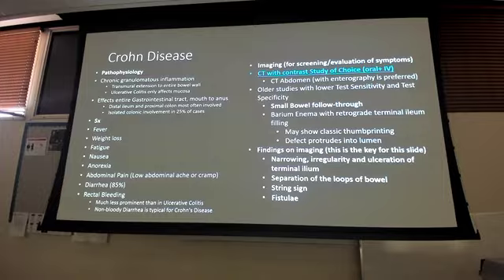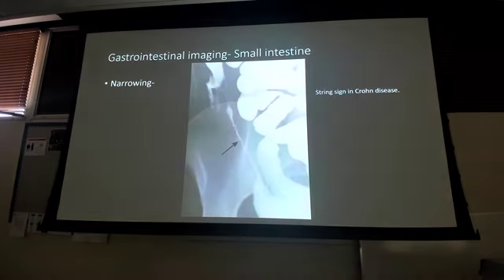All right, so CT with contrast is the study of choice. Right there in blue for you. Sure, you can do a small bowel follow-through like we saw, but it has low sensitivity. But the key things you're going to find on the imaging, if you do x-rays, CTs really, is going to be narrowing with ulceration of the terminal ileum. String sign, we're going to look at. String sign is where you're going to focus for Crohn's disease.